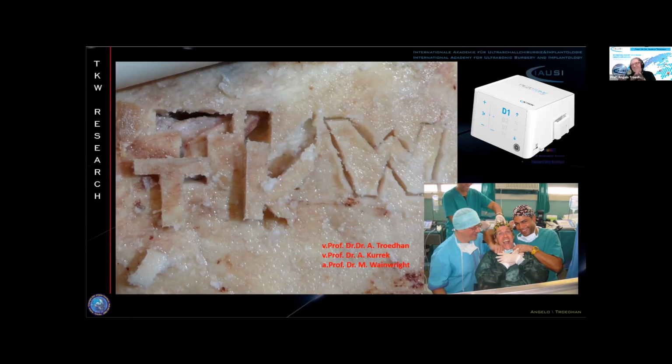First of all, that we are guys just working in our offices, not only high science, etc., etc. We serve our patients. So this is why we do research for the benefit of our patients. And just take this picture home with you or keep it in your mind because you're at home due to the pandemic. It's impossible to do this with rotary instruments.